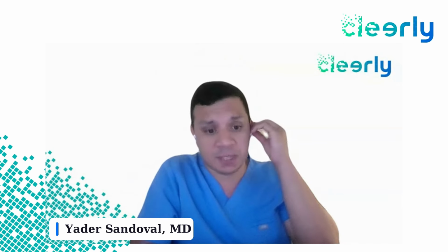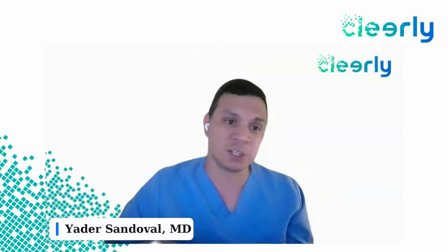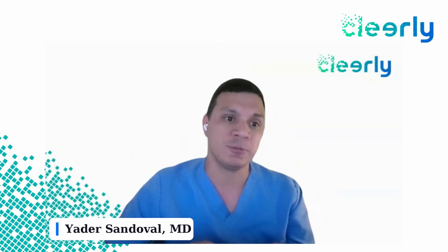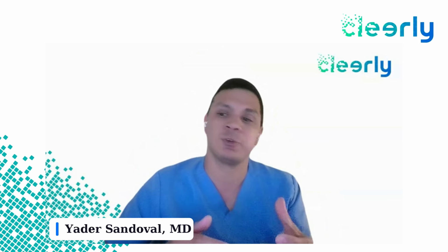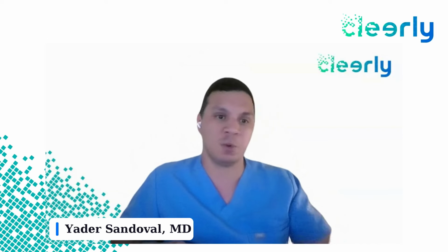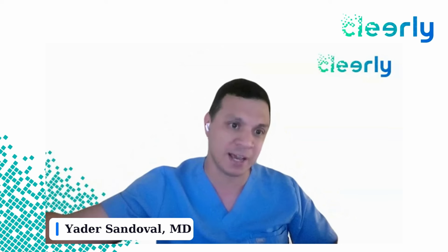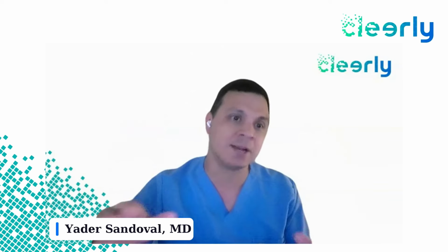I think that's the expectation. We similarly need prospective studies of people actually looking at all this CT information and actually doing CT-guided PCI, which is the whole reason we've done these educational courses, to try to inform interventional cardiologists. Because of course, if you do the CT, but you still do your procedure as you've done it all the time, then it may not necessarily help. But the whole idea is that you look at this, and to your point, you say, I already know where the problem is, so I just need one picture, and I know where the actual lesion is, so I can go up front with a guide. And since you have a plan, yes, you are correct.